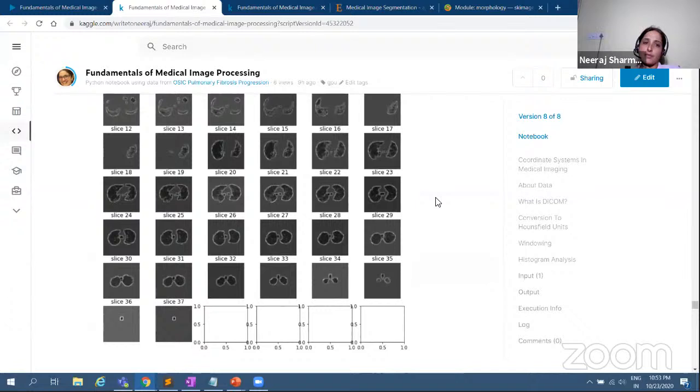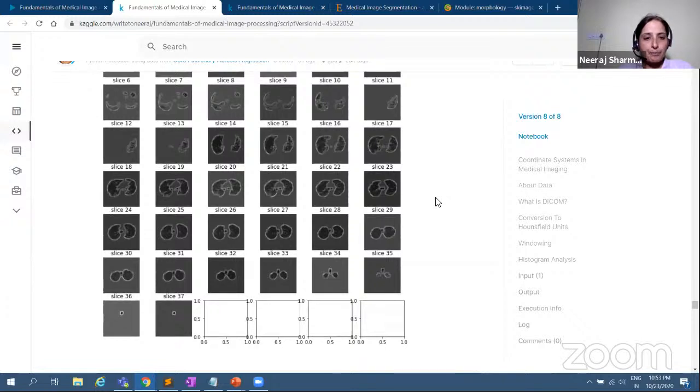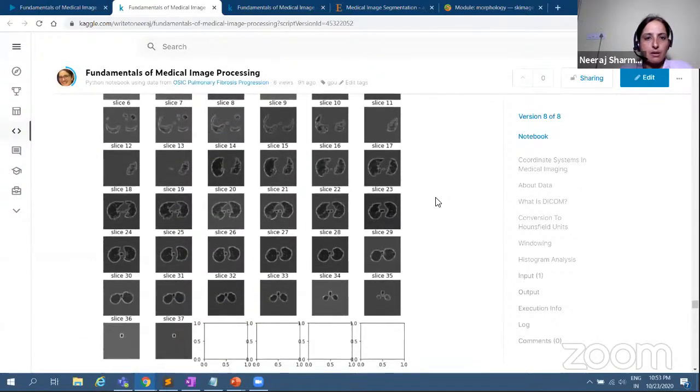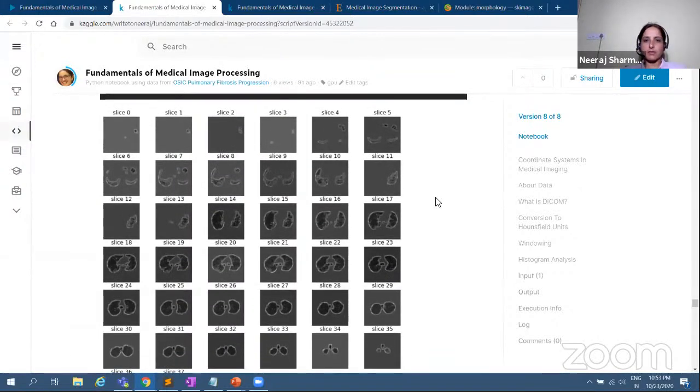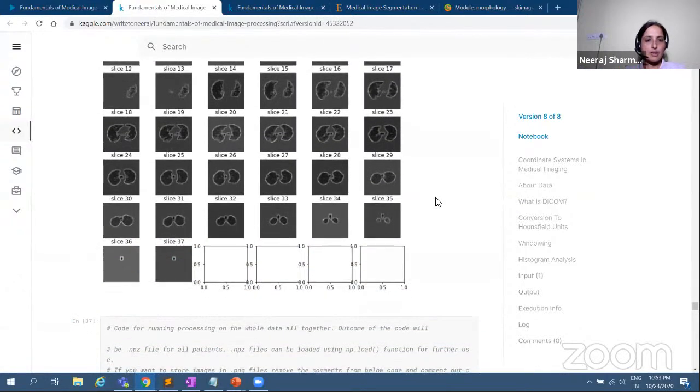But we definitely need to try out resizing. I am not very keen on the resample thing, but definitely it is very important, because we need to make all the pixel sizes synchronized. All the sizes should be the same.